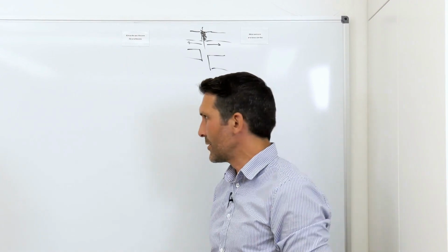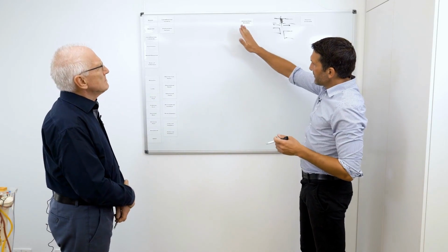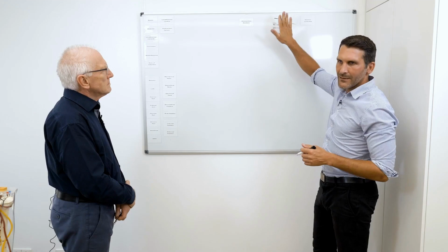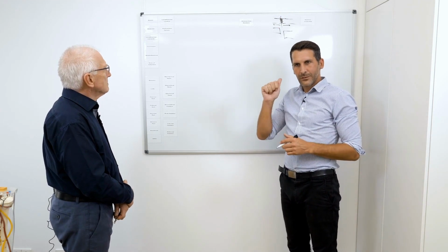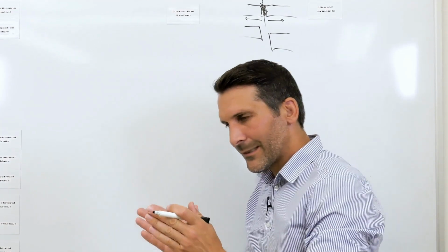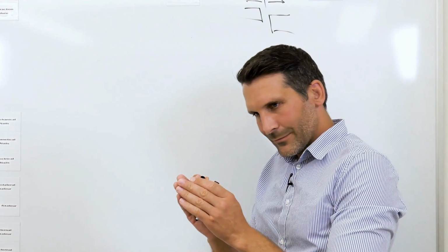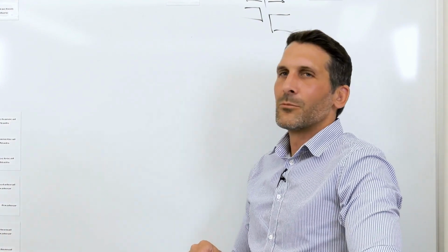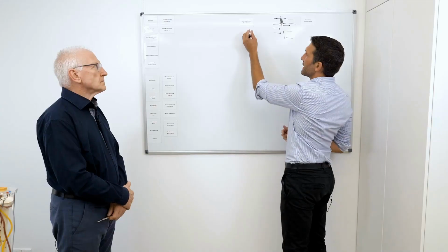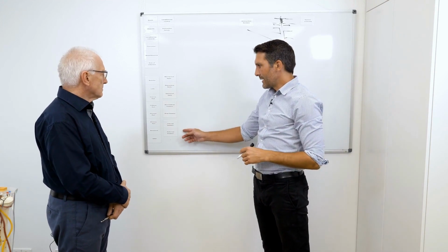So now let's move on to the systems that are supposed to ensure exactly this. Ideally, the defined speed of distraction, which means pulling the callus apart at this specific speed, 0.1, 0.2. But also to ensure stability while pulling the callus apart. And now there are two ways to ensure stability. One way to ensure stability is through an external fixator.